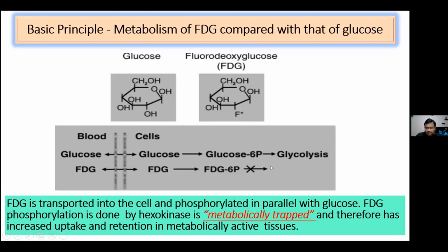And this is actually a positron emitter. So it emits a positron, which is actually an antiparticle. There, inside the cell, it goes into a phenomenon known as annihilation. It annihilates with an electron to form two gamma rays which are coincidence rays at 180 degrees.